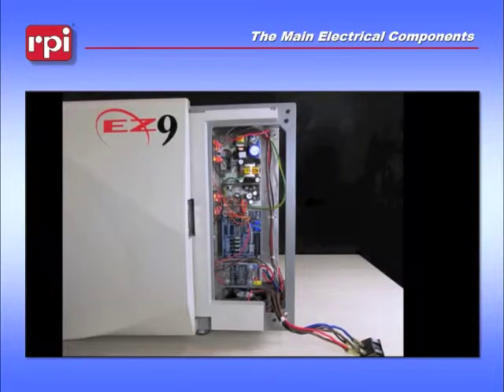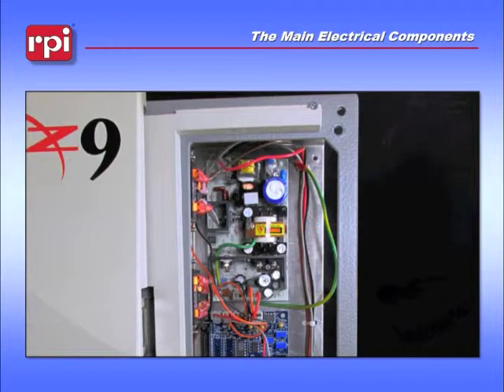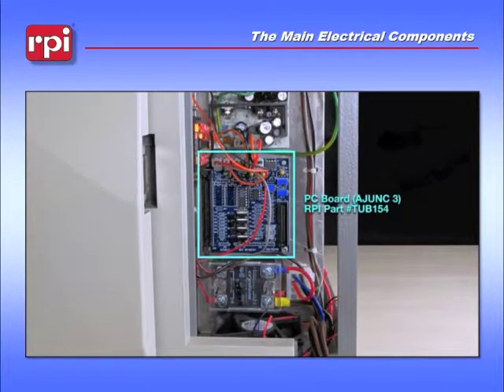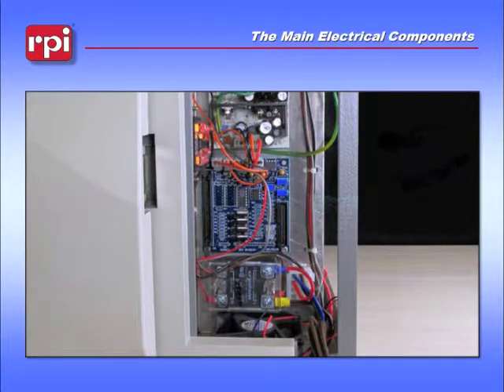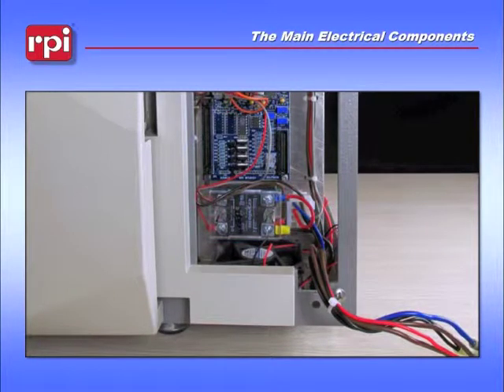Looking straight on at the unit, the very top board is your power supply board, which also offers your 5 and 12 volt DC lines that go down to the Adjunct 3 board, or in some cases an Adjunct 2 board. Just below that will be the solid state relay for your heater. And then at the very bottom of the unit, you will have your cooling fan.